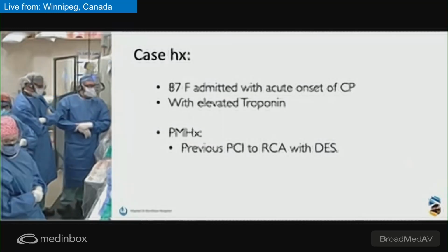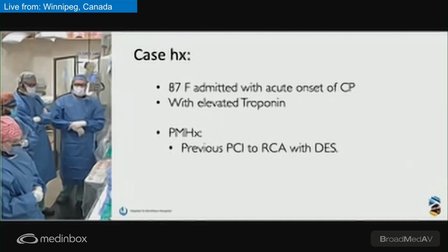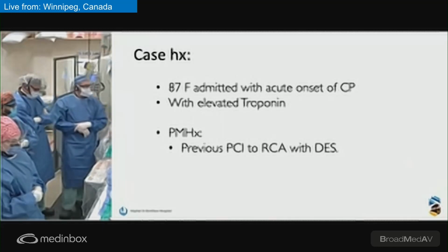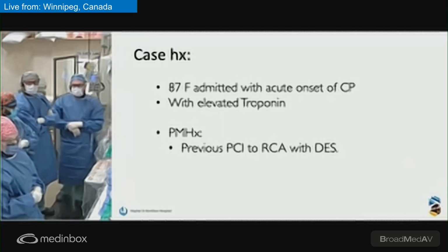So, again, welcome from Winnipeg. We have a great calcified LAD case for you today. We'll do some calcium modification. Our goal is to be able to image the vessel and also be able to do some rotablation and potentially IVL if needed. Let's go to the next slide.